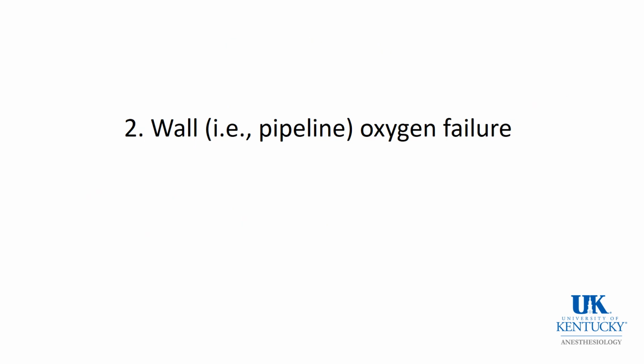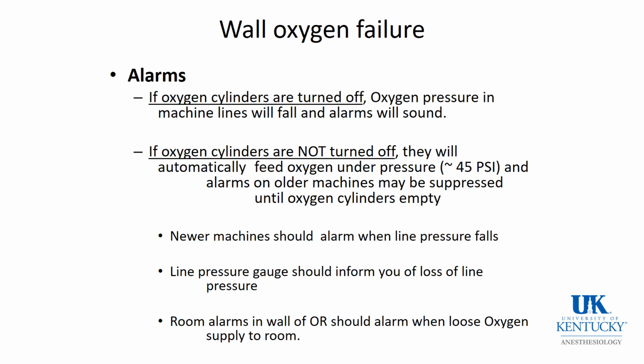Now, another topic is what to do about pipeline failure. As I mentioned, if the oxygen cylinders are turned off, the oxygen pressure in the machine will fall and the alarms will sound.